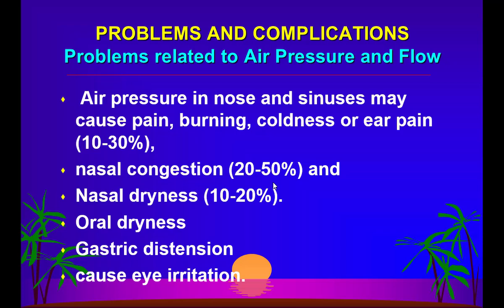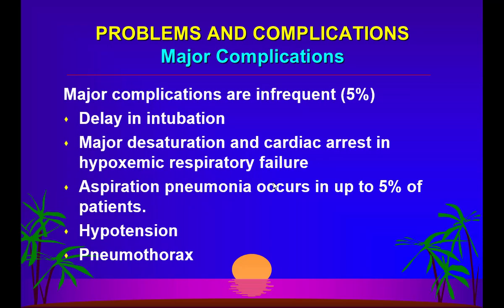Complication-wise, the complications could be nasal congestion, dryness in the nose and oral cavity, gastric distension, eye irritation. Most of these are mask related, and you have to take care of those things. Then the major complication which I fear is delayed intubation. Please do not delay the intubation. Do not drag this patient on NIV for long.